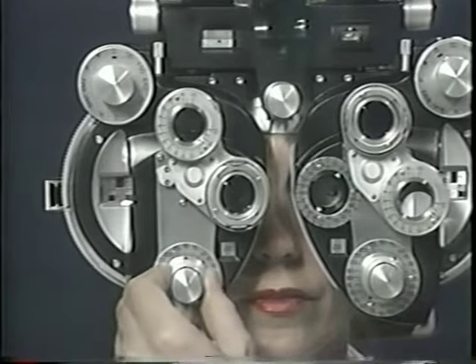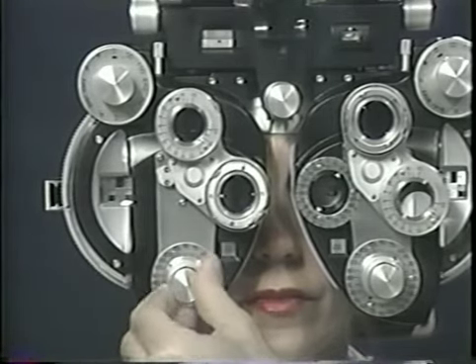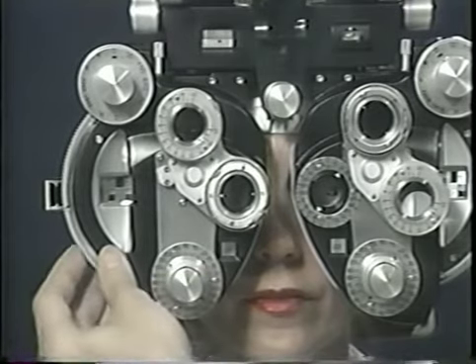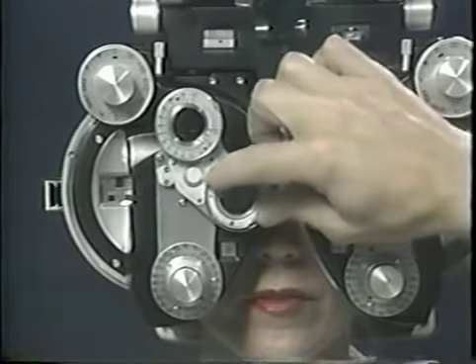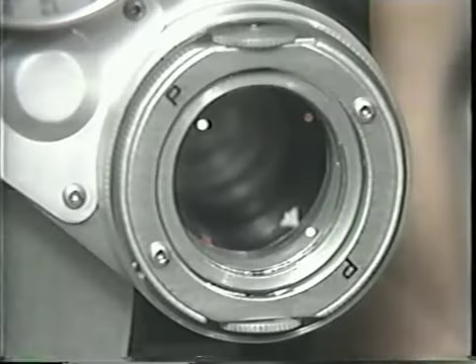This is a plus cylinder phoropter, so the axis is rotated to 135 and 2 clicks of plus cylinder are added, changing the sphere 1 click in the minus direction to keep the circle of least confusion on the retina. The flip choices are presented again, and cylinder power is added until the 2 choices are roughly equal.